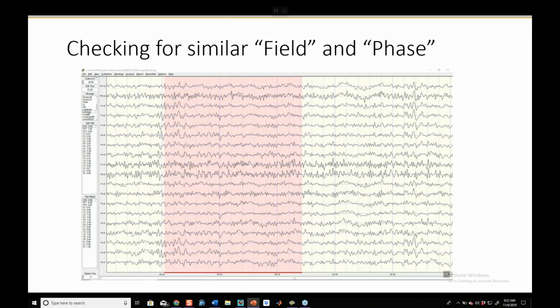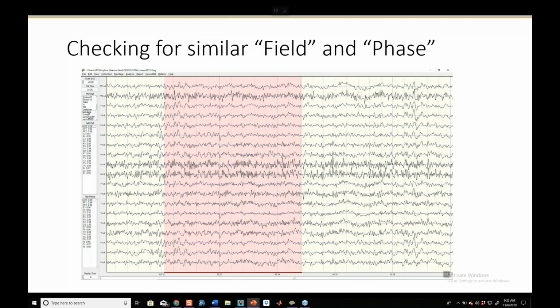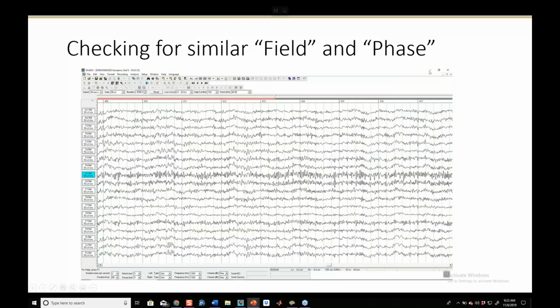What I'm going to do here is first line of defense. I'm going to say, okay, is it real, is it fake? Let's drop that low pass filter and see what happens to O1 and O2. Oh, questionable. Maybe it's real, maybe it's fake. And so in this video, I take us over into WinEEG, another software program, which allows me to do this cool move, right? Boom, look at that, they match.